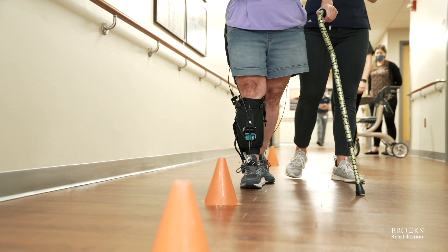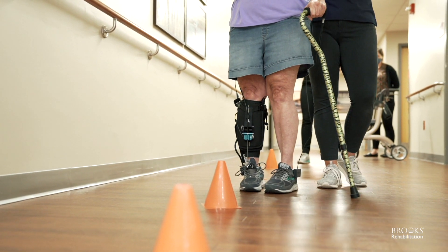Excited to see how this helps with their gait speed and just overall gait quality. Bringing products like Restore to Brooks helps us stay on that leading edge and make sure that we can ensure our patients have the best technology out on the market and we can get the best results for our patients at all times.